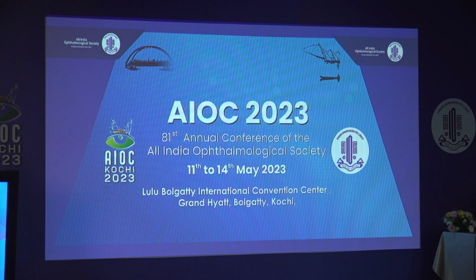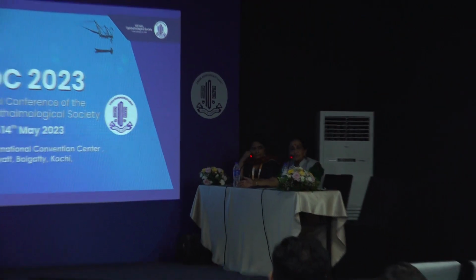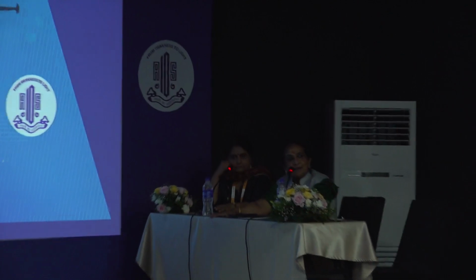No. But I don't fuss too much because anyway these are growing eyes. We don't know how they would grow. So there is anyway unpredictability, unless it's a gross error. Yeah. I had a 3-month-old baby, less than 3 months, and the eye was a little small, but of course the corneal diameter was more than 10.5, and axial length was 17.5. Considering the difficulties of contact lens wear and patching, I decided that I would implant an IOL. The power was 42, and I implanted 30 diopters.